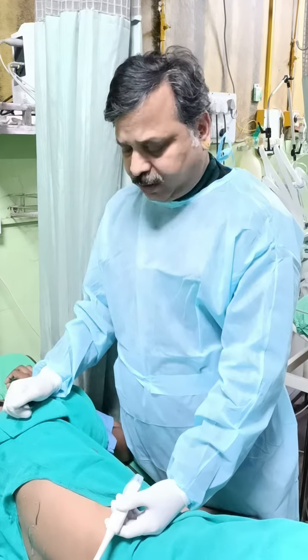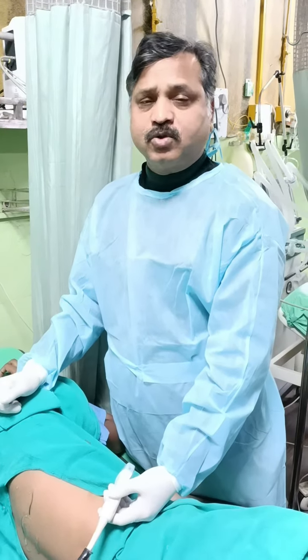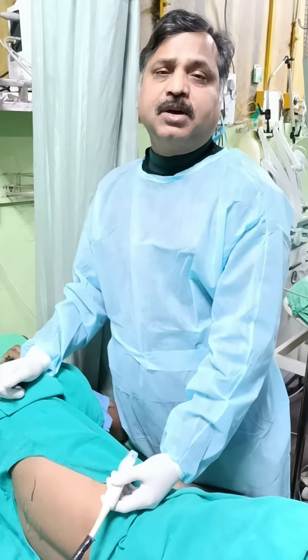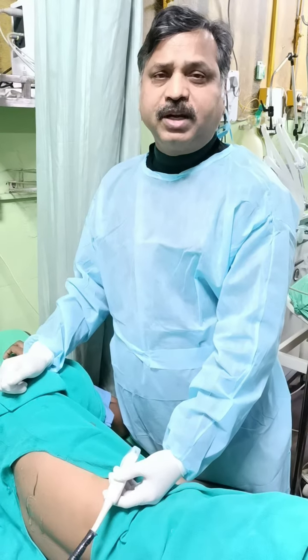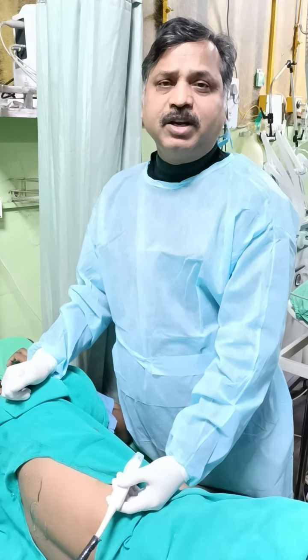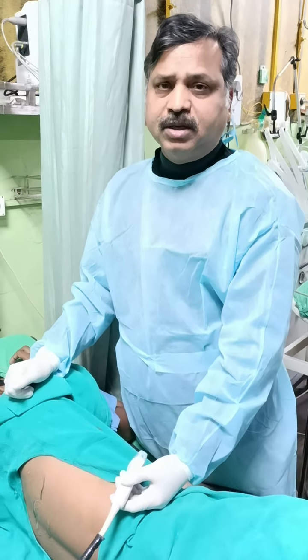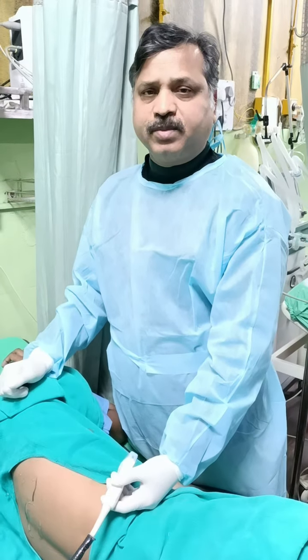I will be going through the transverse approach. In fact, there are two approaches to do the erector spinal plane block — one is longitudinal and the second is transverse. So I will be using the transverse approach.